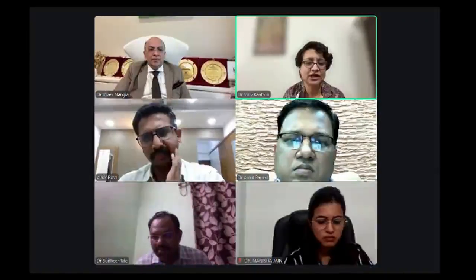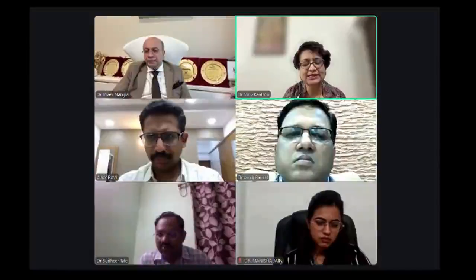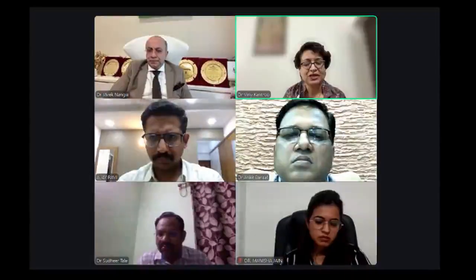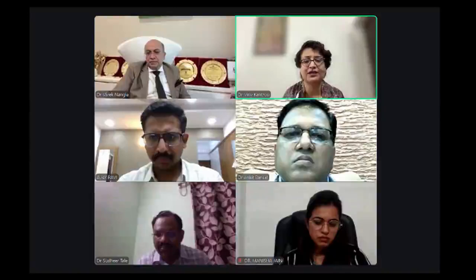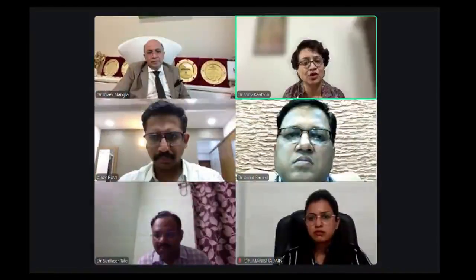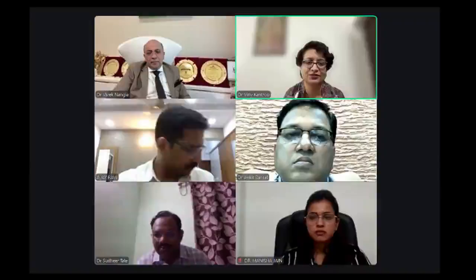The relative contraindications would be an uncooperative patient, uncontrolled arrhythmia which is not malignant, a uremic patient wherein the patient is on dialysis, and certain kinds of patients having hypoxemia or respiratory failure, wherein the requirement for oxygen is something like more than 3 to 4 liters of oxygen per minute. So these are some of the contraindications and relative contraindications.